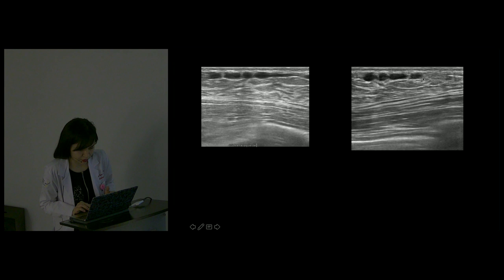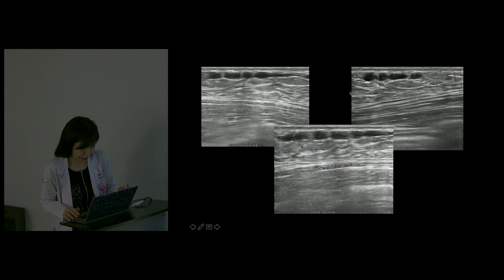of the left breast. We found a tubular structure which was also serpiginous and hypoechoic, and in the Doppler color mode, this structure does not present flow signal inside. This finding represents a thrombosed vein, which is characteristic of Mondor disease.